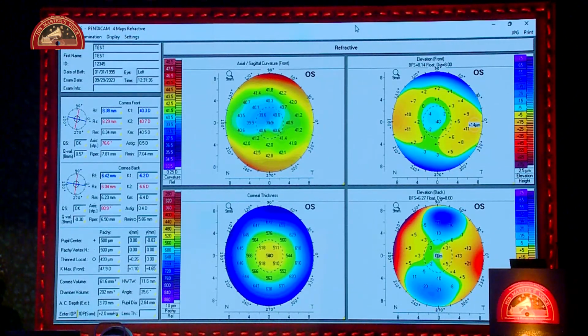In fact, we had taken one video of such kind of thing. I don't know whether the resolution allows us to share the video. Akash had made a video that, as Dr. Tityal said, shows the way the Pentacam works: it throws a blue color light, which scatters less, a slit of light in the center of the cornea. Because the entire rest of the cornea is not illuminated, it's not visible there. But if you keep the ambient light on, the cornea in front and behind would actually be visible. So that's not the best thing, and hence, as Dr. Tityal said, it's very important to keep the ambient light dark.